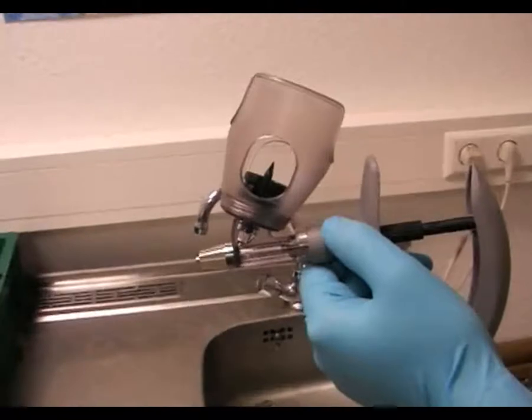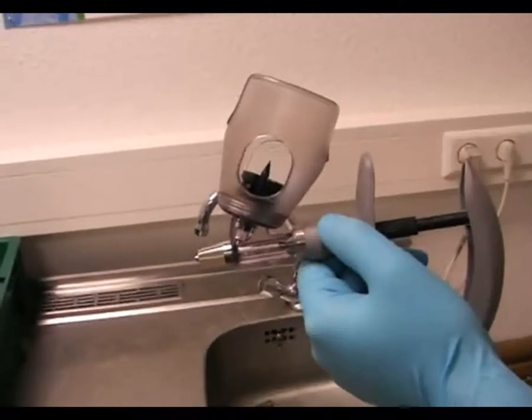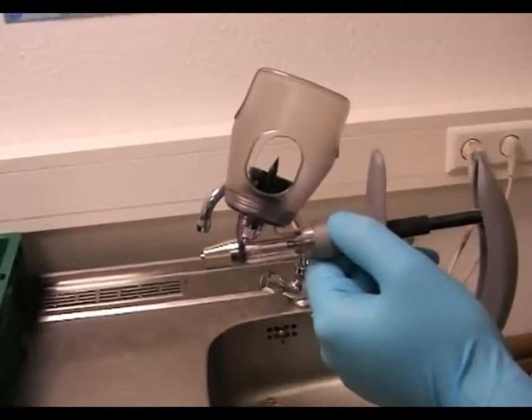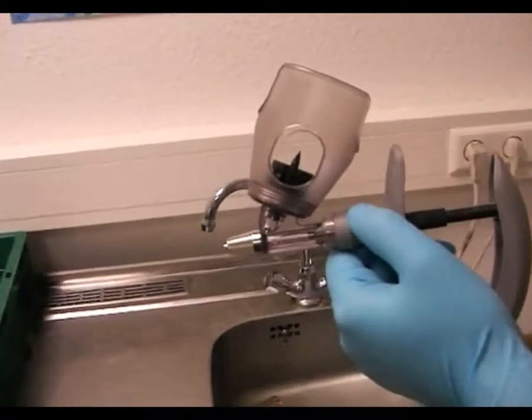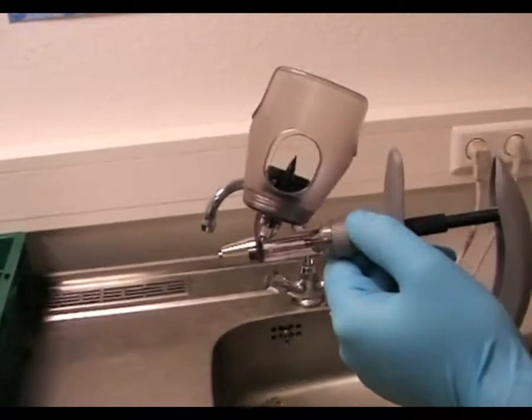Sie sehen, die Spritze besteht aus einem sogenannten V-Griff mit Korb, Flaschenaufnahme und dem darunterliegenden Zylinder mit Metallkanülenansatz.